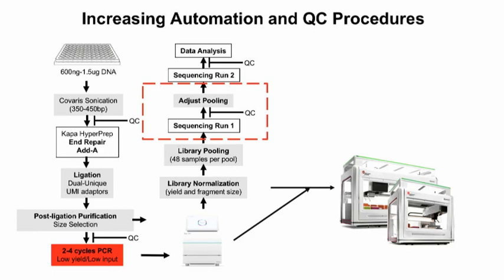And then since we also run a clinical laboratory, in the last CAP inspection we did, they were very, very positive of that sort of workflow. So just as an FYI, if it's helpful. Again, all we did was switch up the pairings.